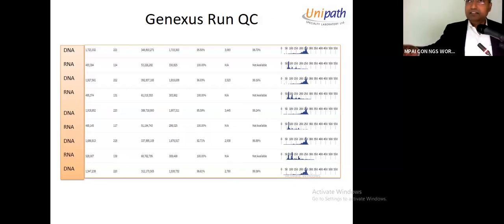And there the challenge is, somebody is asking, when to use Sanger sequencing for confirmation? So people tend to use Sanger sequencer for verification of their variants if they're not sure. Or if my recommendation is 1000x, I'm doing 250x, getting a single call, am I confident? Even with all the protocols I'm using, you may need a sample to confirm. So sometimes you need additional techniques to verify that.